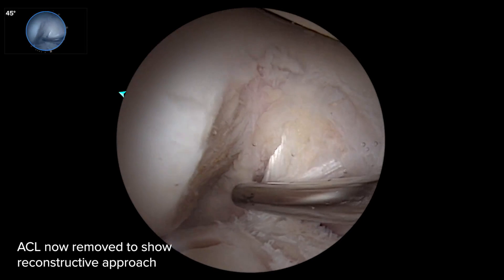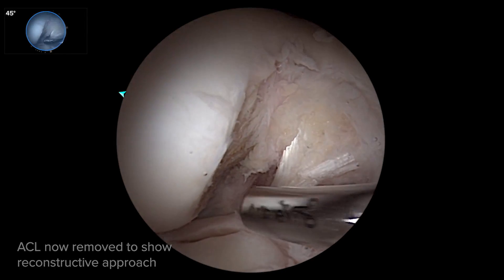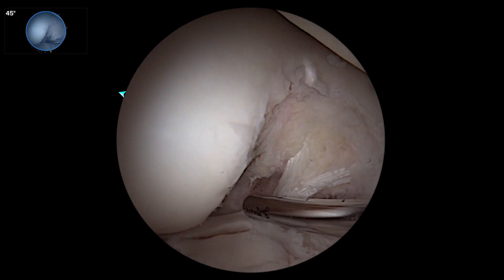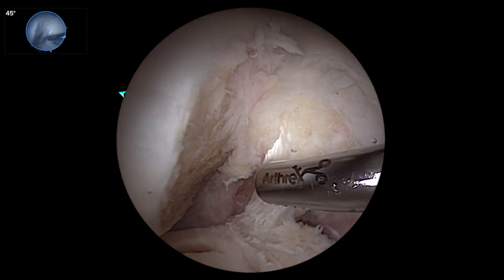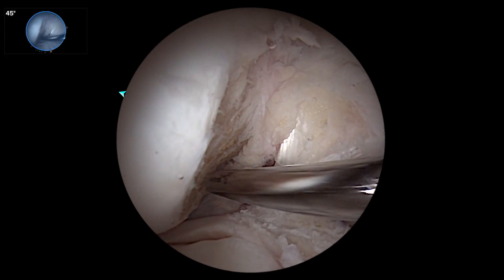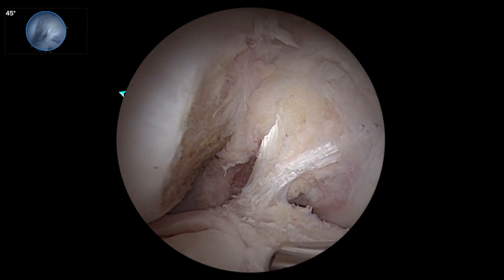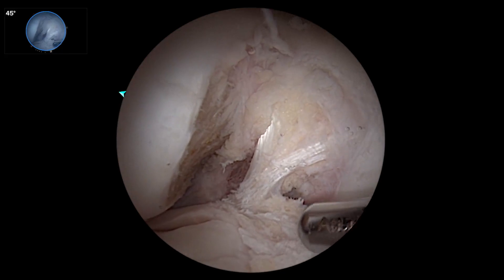This wide-angle panoramic view, just cleaning out the notch — when you're allowing trainees to do this, you worry about them injuring the root of the lateral meniscus, and this wide-angle or panoramic view is just incredible. I can see it perfectly, I can see the sidewall perfectly, and you can tell I've already debrided the ACL stump out of here.